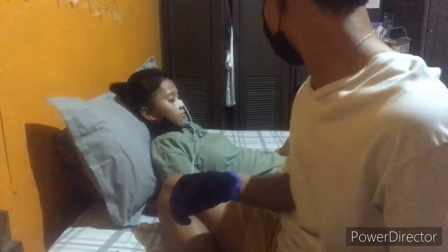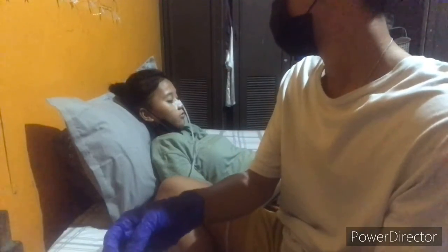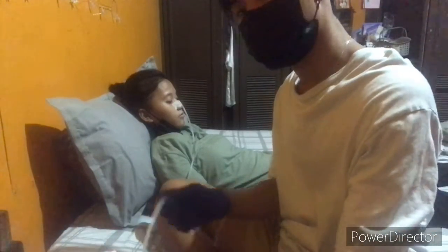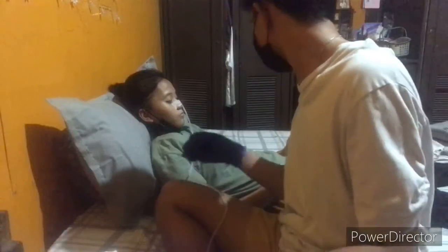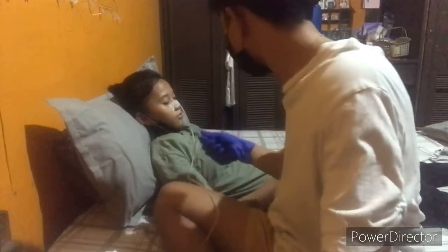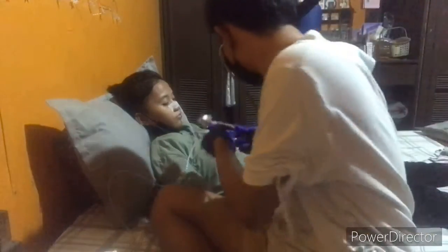Determine tube placement. Aspirate gastric contents to check for gastric residual. Return aspirated content to stomach unless the volume exceeds 150 ml. Measure pH of aspirated GI contents. Observe the aspirate's appearance. Consider the results from pH testing and the aspirate's appearance together. Presence of gastric secretions indicates that the end of the tube is in the stomach, and residual volume indicates if gastric emptying is delayed. Delayed gastric emptying may be reflected by 150 ml or more remaining in the client's stomach.